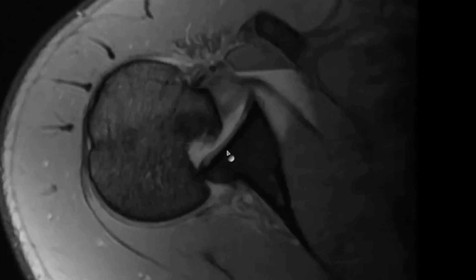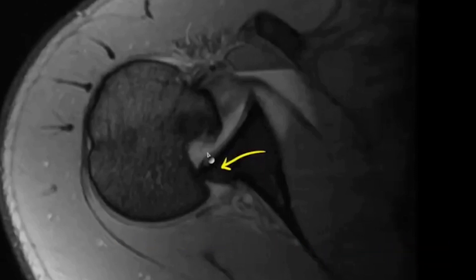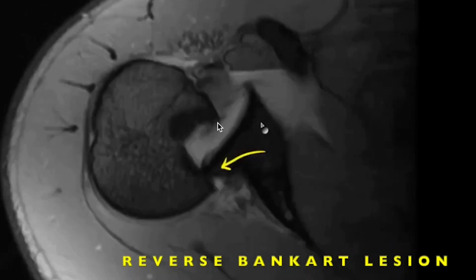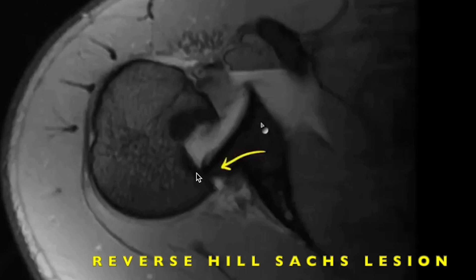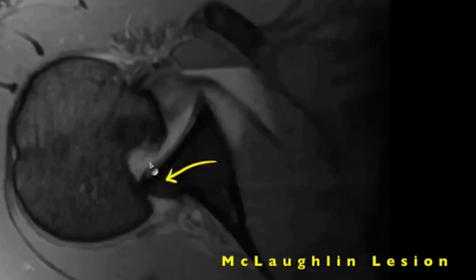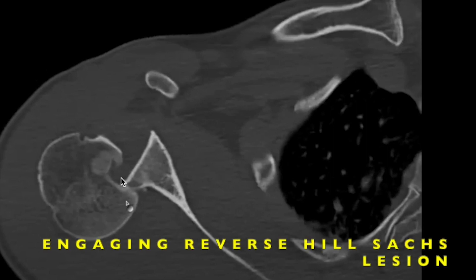This is another case where the patient presented with acute shoulder dislocation. MRI demonstrated posterior dislocation of the shoulder with the humeral head displaced posteriorly. The anterior glenoid labrum appears normal and the posterior glenoid labrum shows increased signal intensity with deficit, suggestive of reverse Bankart lesion. The impaction fracture in the anterior medial aspect of the humerus is suggestive of reverse Hill-Sachs lesion — also called McLaughlin lesion — which is seen in posterior dislocation of the shoulder. CT image of the same patient demonstrates the posterior dislocation along with the bony defect in the anterior medial aspect of the humeral head engaging with the glenoid, called engaging type reverse Hill-Sachs lesion.